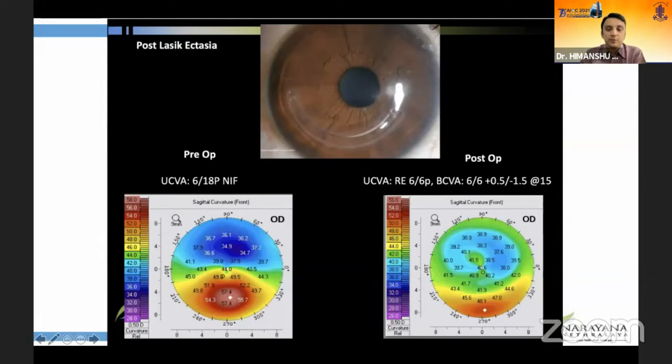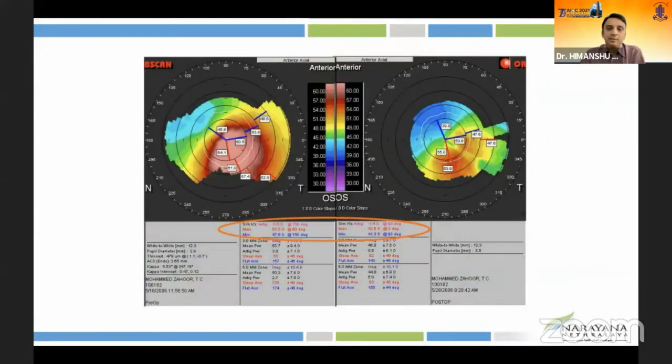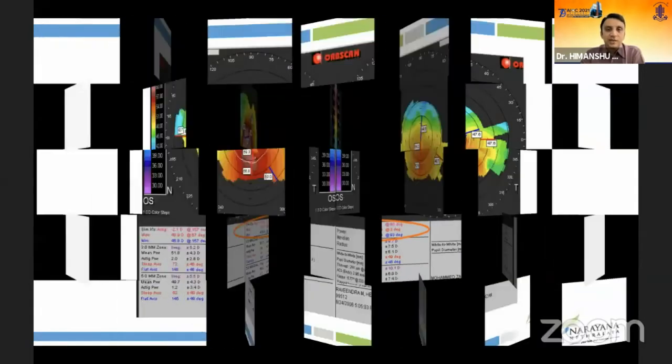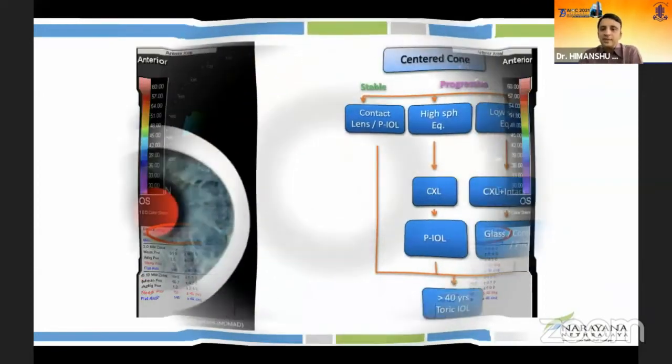So the myopia exposes. If I do DALK, well, I'm negating the effect of LASIK. The myopia comes back. So here, if I have to do something, only one thing, well, that would be my intracorneal ring implants. Intracorneal ring implants work in many cases, but as I said, to titrate the visual outcome can sometimes be difficult. So we have to combine with something else.